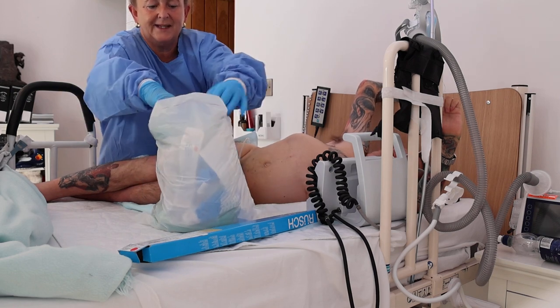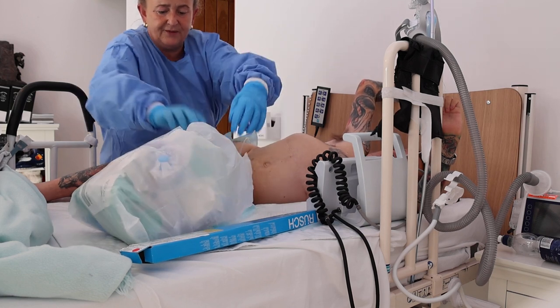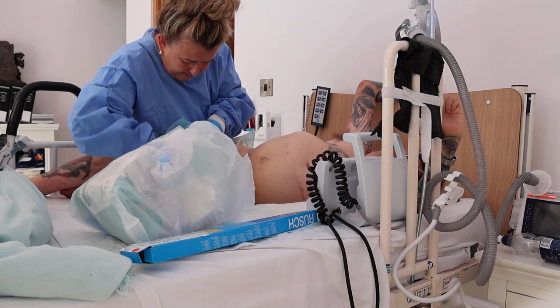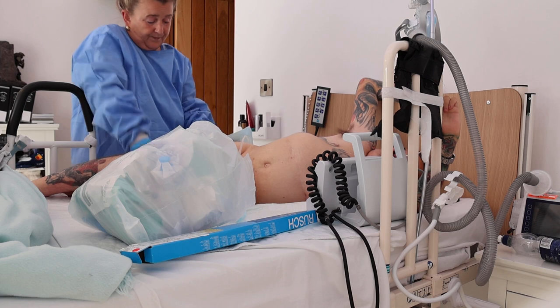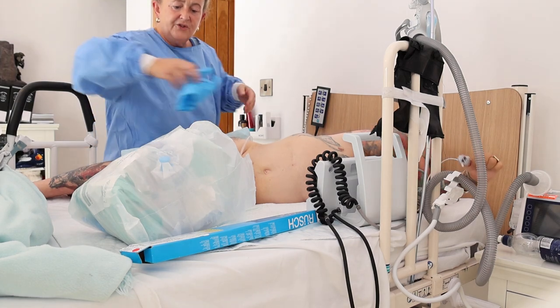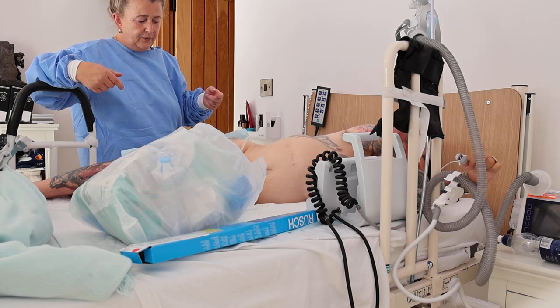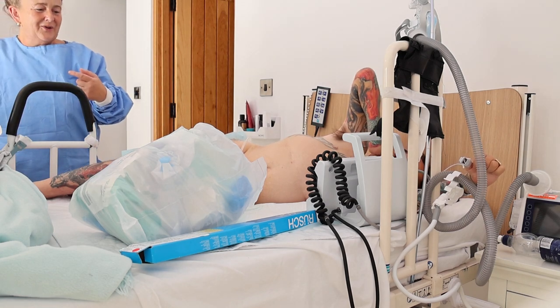Try not to cross-contaminate yourself, or your client, or persons or whatever. I'll get rid of those in a minute, but because I'm working with a dirty area, what I do now is put a clean pad underneath. This is a little tip. Take your gloves completely off now and just wait. I'm waiting to wash my hands, but what you're waiting for is basically, is the person still going to be double incontinent at this stage? 1, 2, 3, I don't think so.